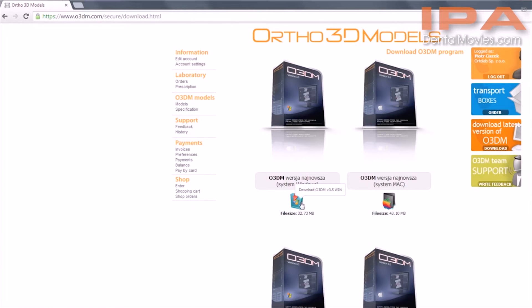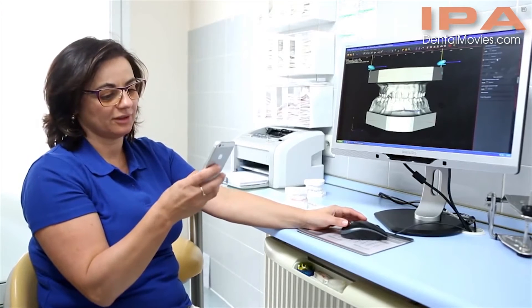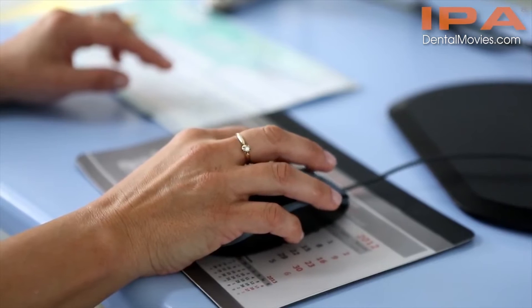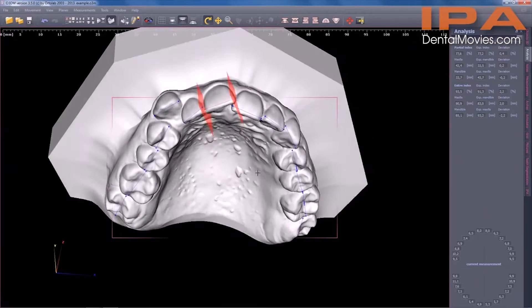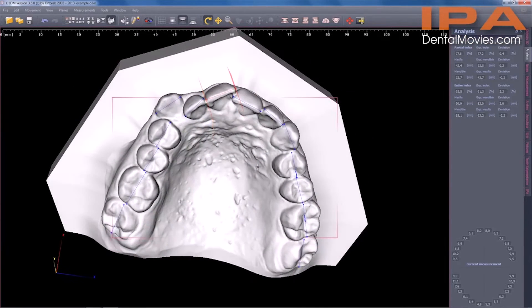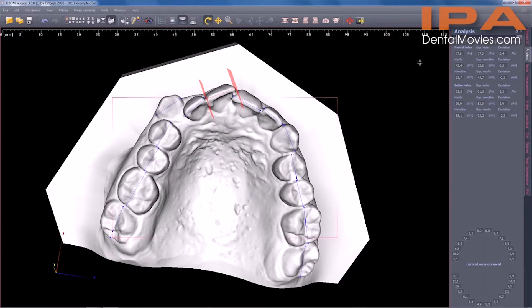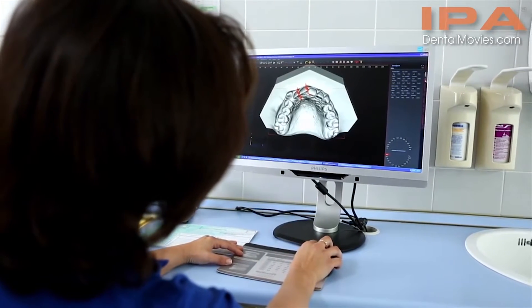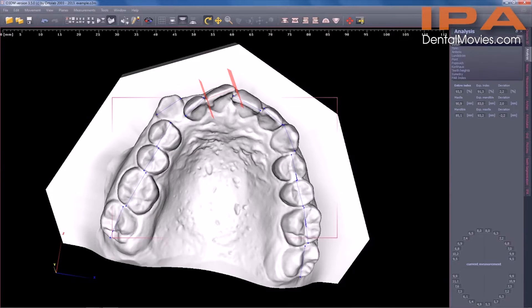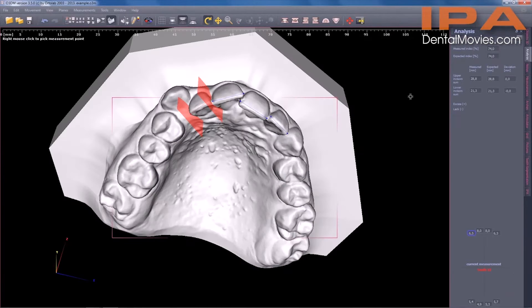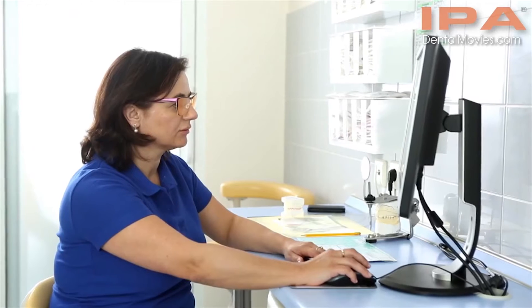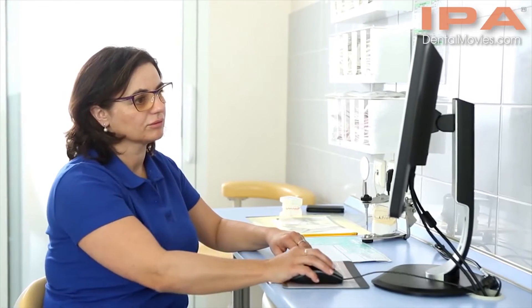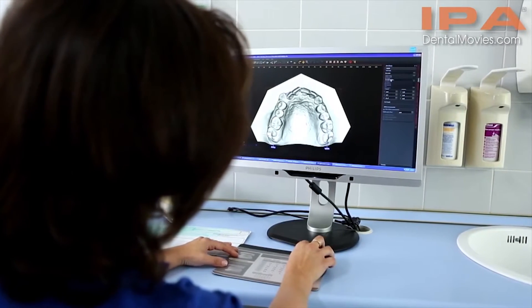A dentist can get personal or online assistance for any technical problem occurring when working with the O3DM program. The downloaded virtual model contains ready-to-use measurement points which make it possible to generate almost automatically the most important analyses necessary for treatment planning and allow for individual diagnostic procedures. All results generated in that way are saved in a model file and can be used by the dentist at any time.